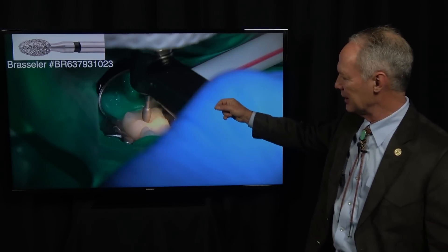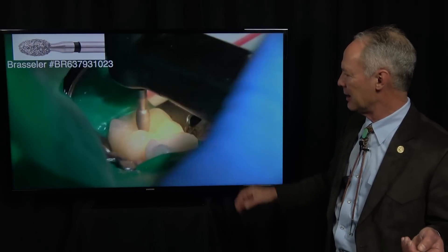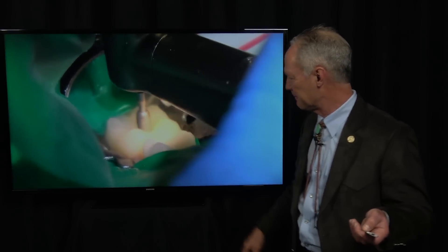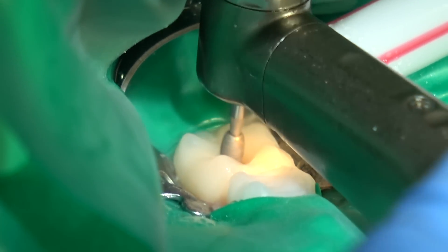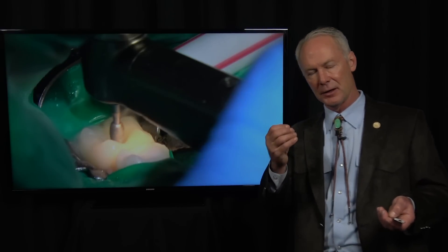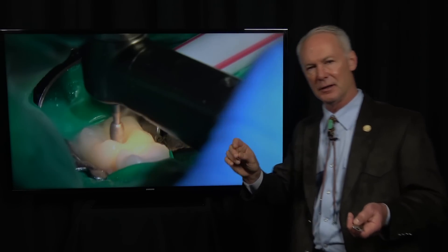So this is just a part of life. With very light pressure and lots of water, with a coarse football diamond, I'm cutting through the occlusal surface of the crown. This could be e.max, porcelain, zirconium, or porcelain to metal. If there's metal involved, you cut through the tooth-colored part with a coarse football diamond, and once you get to the metal, you cut through that with a 330 carbide bur.